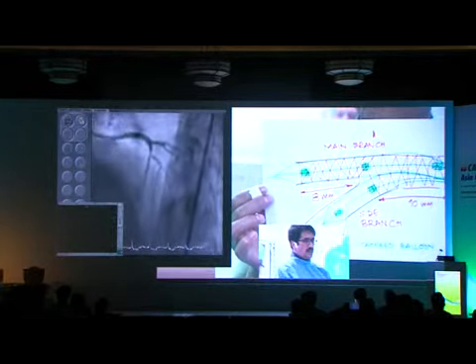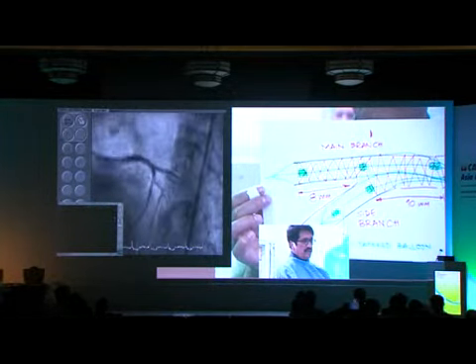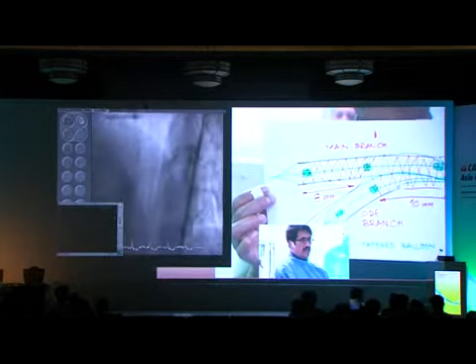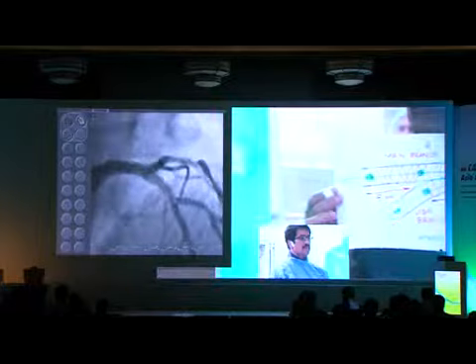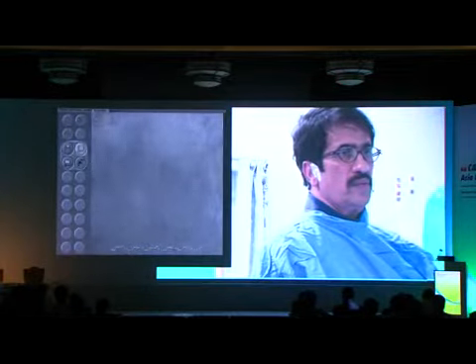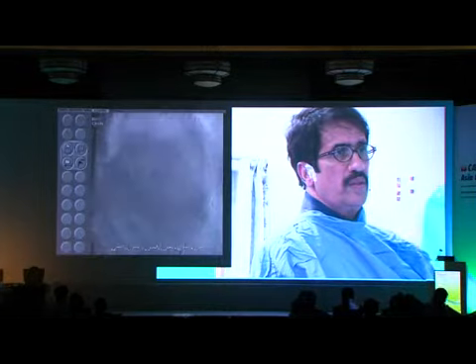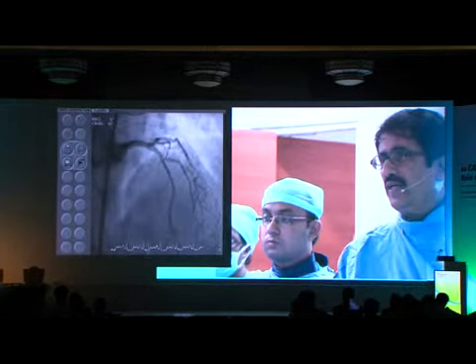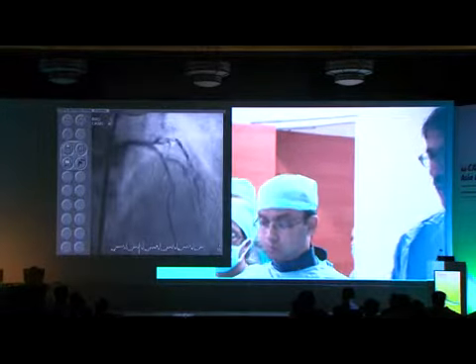So 8 is a constant figure, and that's the side of the stent. See here, we are going to get the 8 millimeter beyond the carina. So first we dilate the lesion.